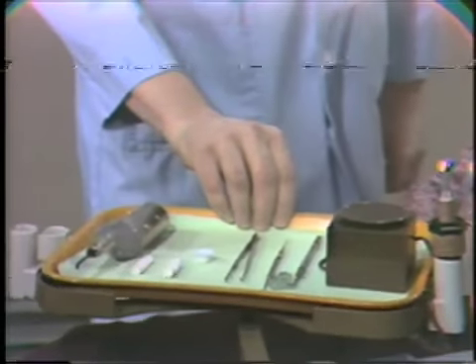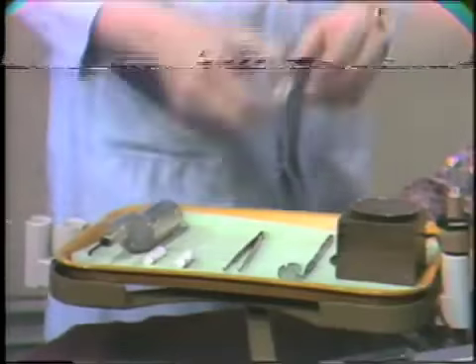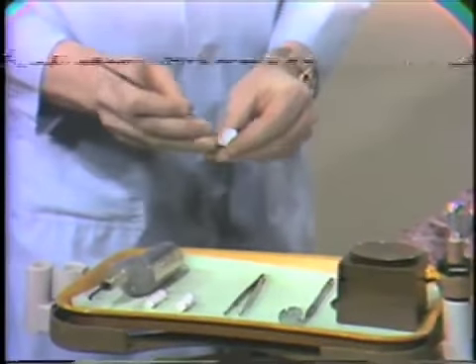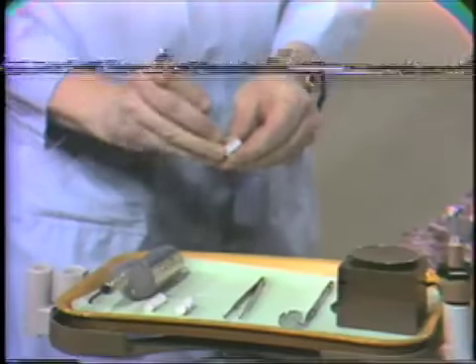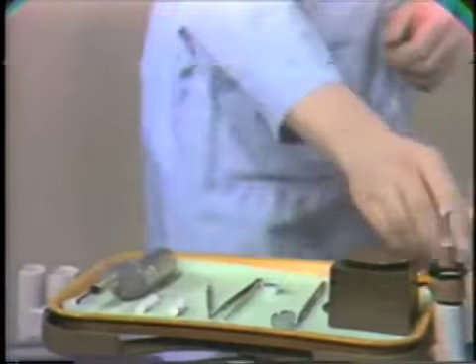Now I'm going to start out by going through the first step of this procedure, which is giving this young lady a pumice prophy on the 6 anterior teeth. It's the 6 anterior teeth that usually we bleach on people that have staining like this. This is what they show to the public, and this is what is best lightened, or easiest lightened.